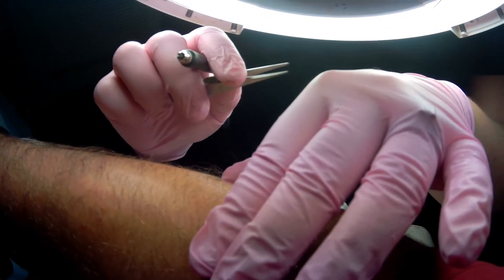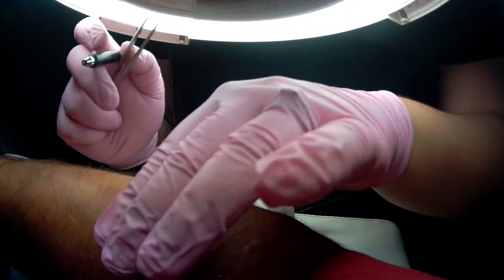Did I have a bulb? It did, didn't it? A little bit. Alright — bulbs mean anagen phase.